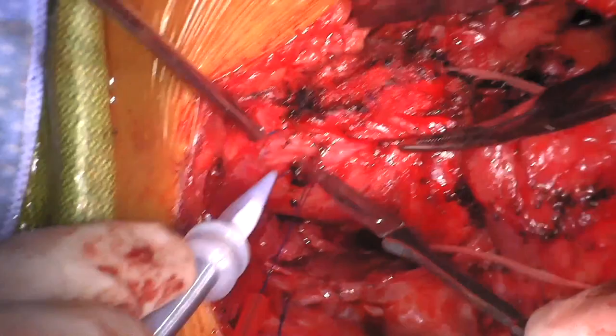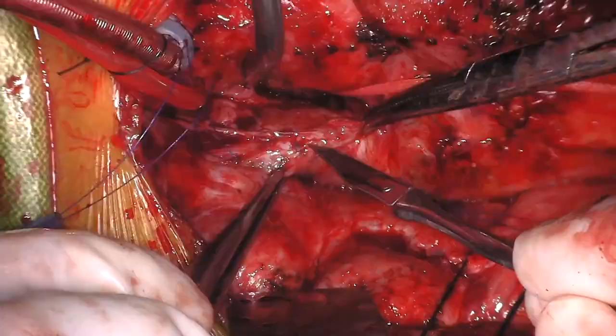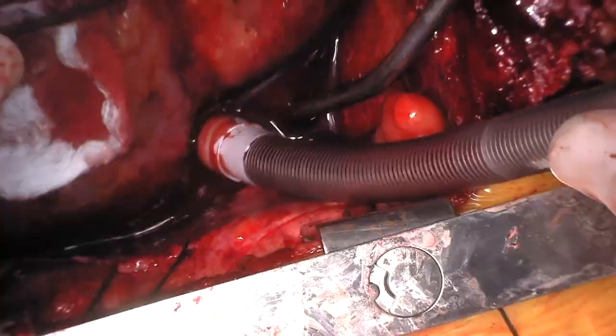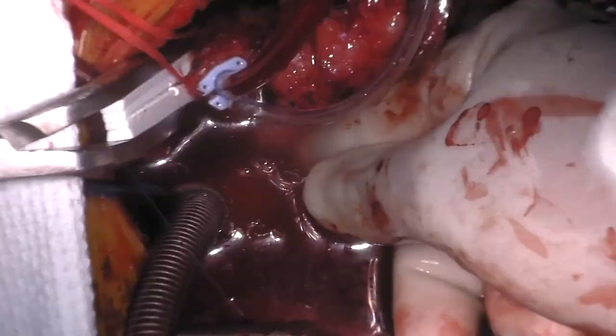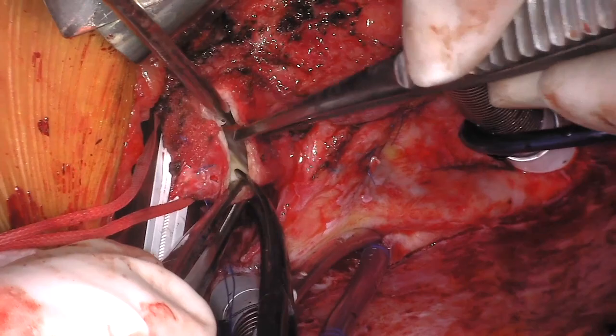Redo sternotomy has been performed. Patient is placed on cardiopulmonary bypass. The heart is allowed to eject because of the aortic insufficiency until aortic cross-clamp is applied. Cardioplegia is given, antegrade initially with some pressure on the right ventricular outflow to decrease the AI. Once arrest is obtained, the aorta is opened and additional direct cardioplegia is given.